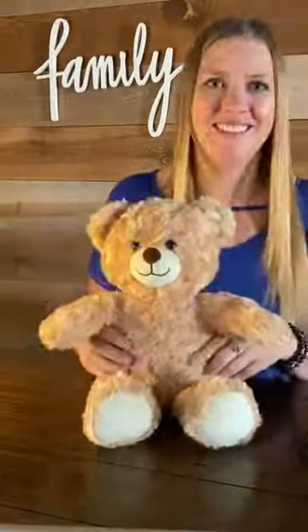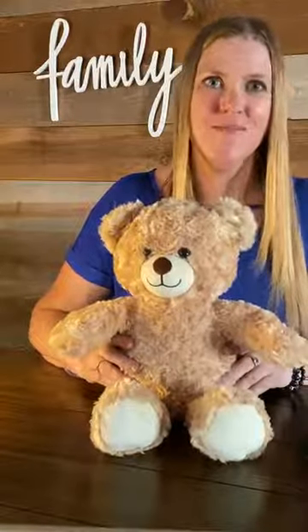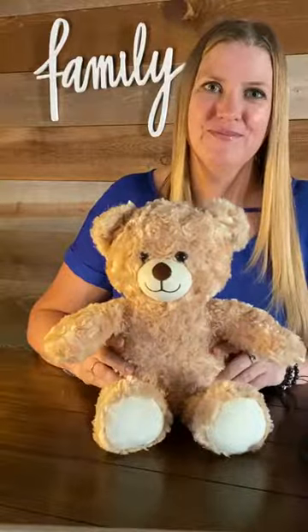Hi, I'm MediBear. I'm here to help you remember to take your medicine. Every morning at this time, I will ask you if you took your medicine. I will ask you again in 10 hours, then every day at the same time. Let's get started.